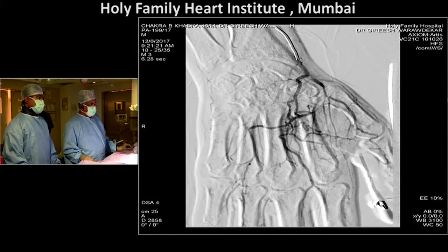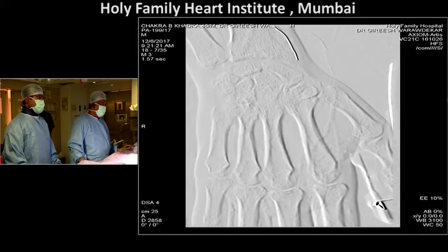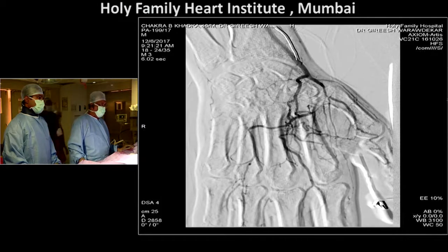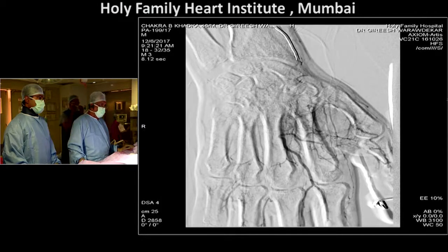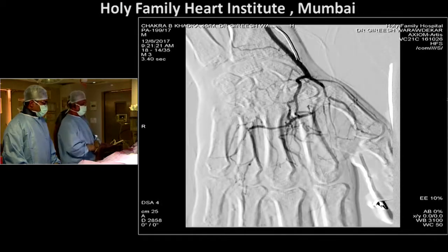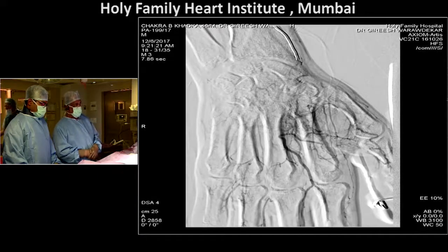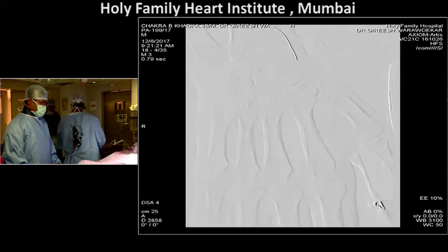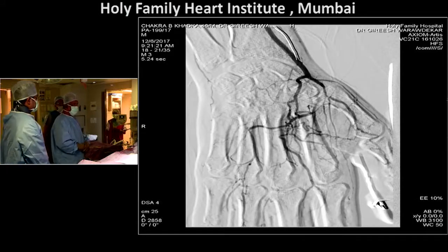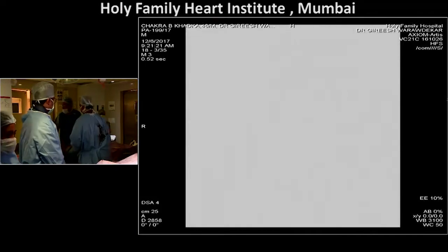Right. So now I'm planning that maybe in the brachial segment I might use a bigger balloon and do plasty. Okay. So yes, we should see what is happening in that territory, for this worry of distal embolus. Yeah, Gireesh, when you're worried about distal embolus, do you like to use filters in these kind of patients?